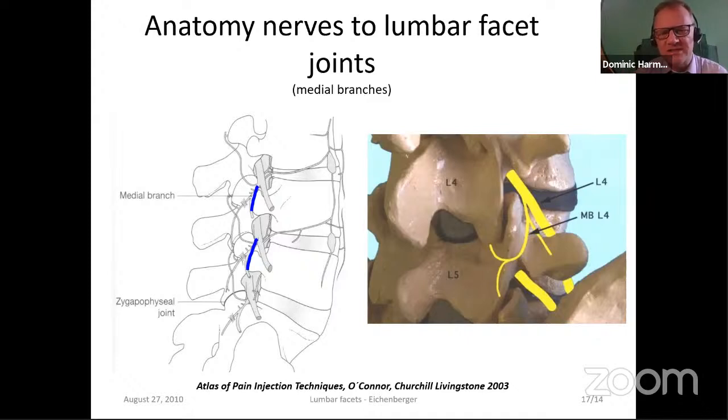So you have this concept of either doing facet joint injection or doing medial branch. And the medial branch innervates the joints, but also innervates the paraspinal muscles. So quite commonly, I would nearly do both types of injections. Maybe in more elderly patients, aiming more towards the joint injection, and in younger patients aiming more towards the medial branch. Okay, and we'll mention things about both of these.